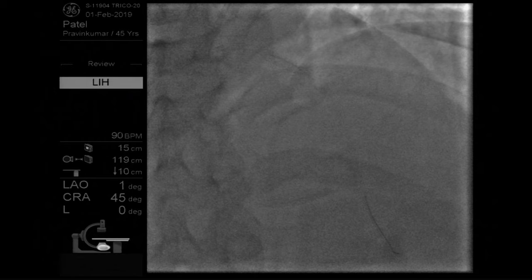In this case, if you do the OCT before putting a stent, 4.5. Go to AP caudal or LAO caudal position. So stent expansion capacity, I think, can go up to 0.5 or 0.75, and Synergy can go up to 0.75 or 1 or so. Any comment? We are taking the 4.5 balloon. We will go at low pressure and try to expand it as much as we can.